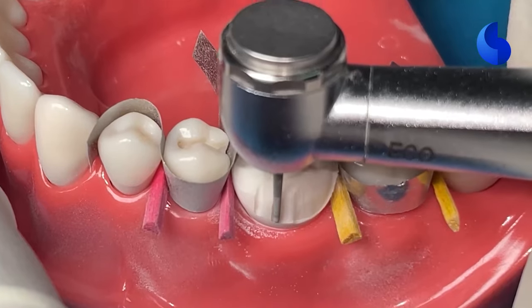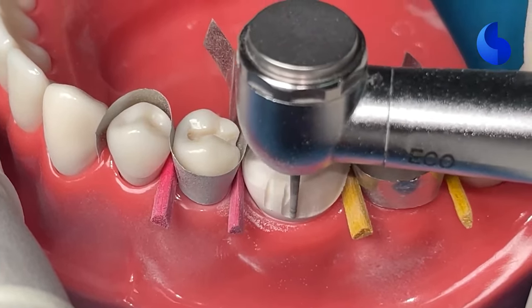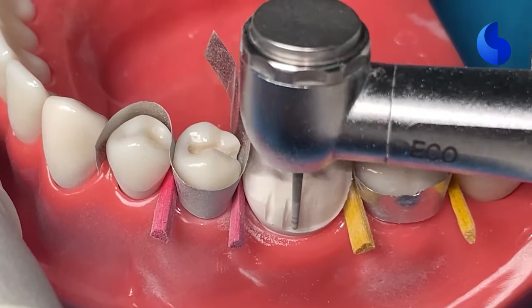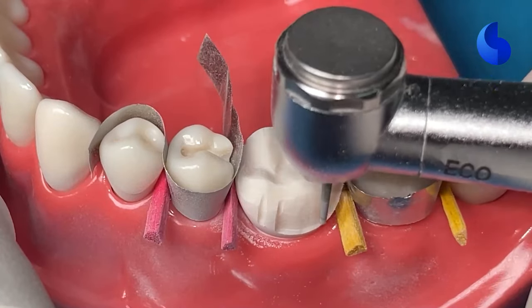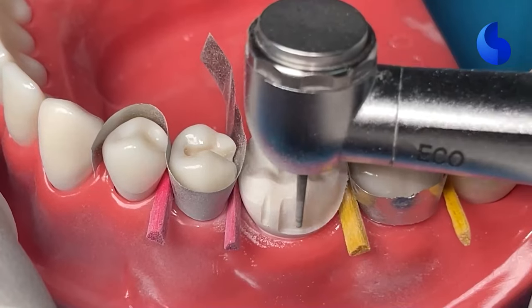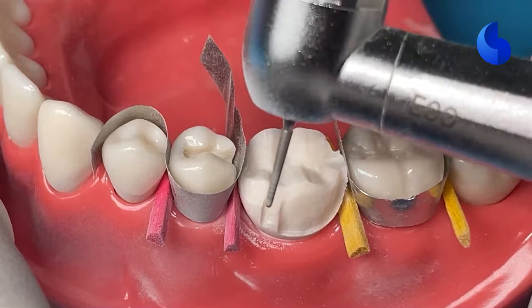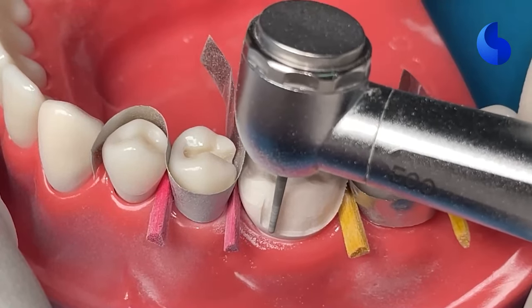So as you can see, when we move the burr towards the proximal surface, we're leaving a very small amount of tooth structure interproximally. So try as much as you can to go into the interproximal while you're preparing the buccal and the lingual axial surfaces, so that when you go to break the contact, the step that most of us hate, you only have a little bit of tooth structure left and the process becomes a lot easier.